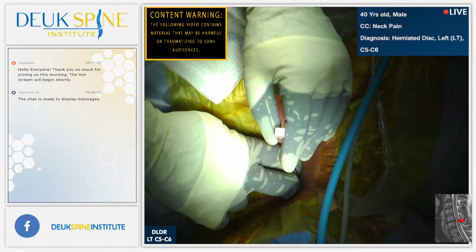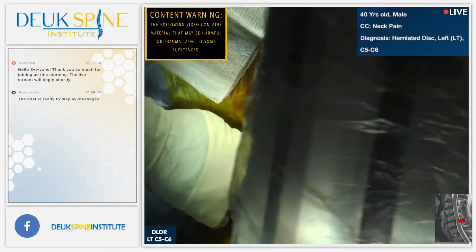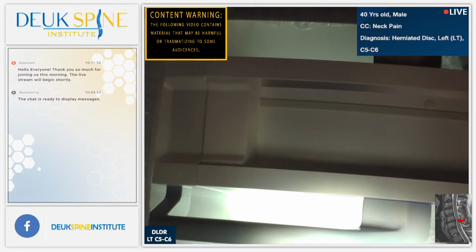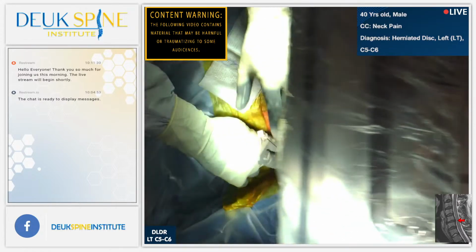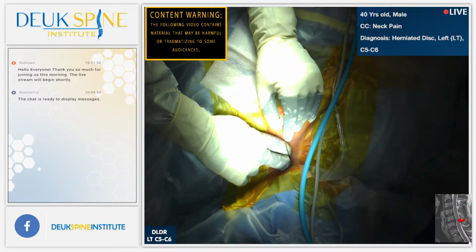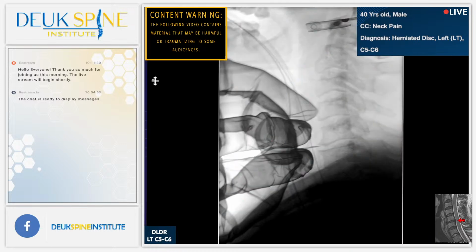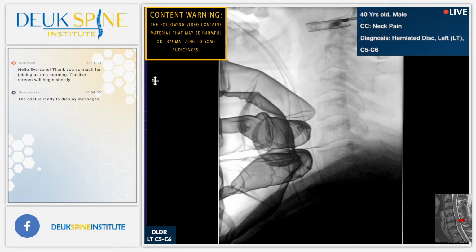All right, it is October 10th, 2023. I'm Dr. Deuk Majan. We are performing the cervical Deuk laser disc repair on a patient who's traveled here from Canada. He was supposed to have this procedure done last week, but our air conditioning system went kaput, and so he's here today to get it done.